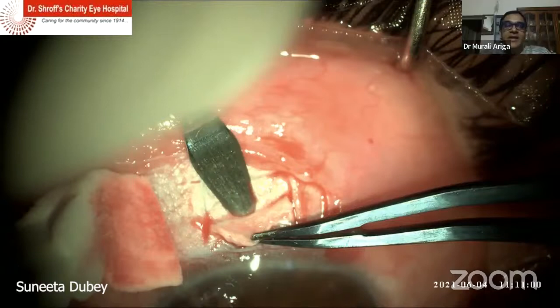Sometimes if you are making the flap with the 15 blade and you're not as experienced as Ganesh is, you may tend to get jagged, uneven cuts in the undersurface of the flap. So it makes sense for a beginner or some relatively inexperienced glaucoma surgeon to use the crescent so that you can at least get a smoother undersurface of the flap. And a half thickness flap and triangle between 4 to 5 millimeter diameter. So 4 to 5 millimeter is the preferred.